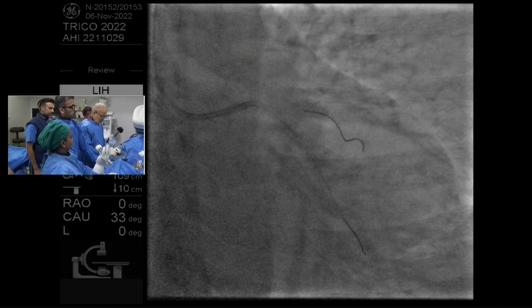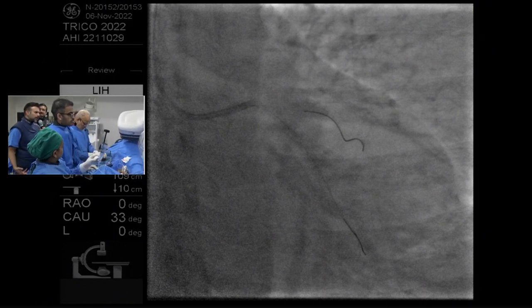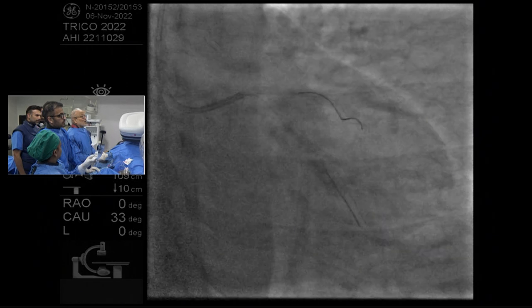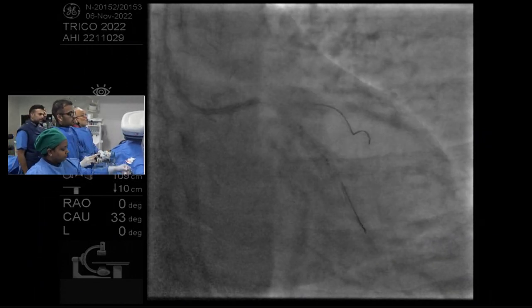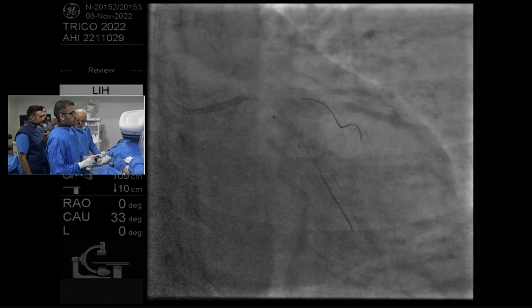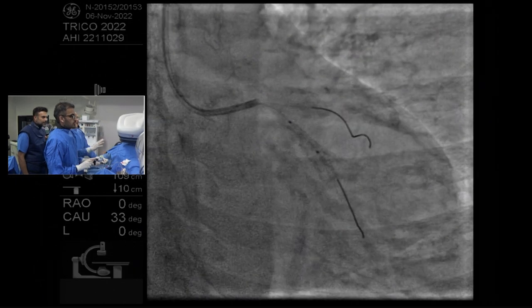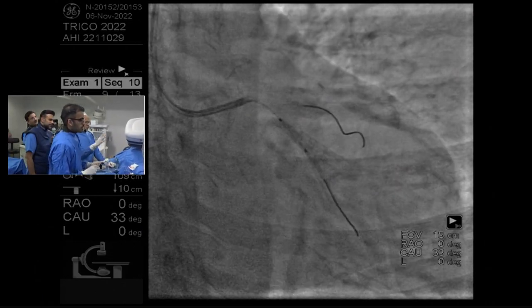You see the name, they changed it to near zero? Yeah, it should be ultra low, right? Or near zero contrast, yeah. Because it's doable with zero, but there's just no need, right? Only difference, Sanjog, I feel is I would cone in. If I were you, I would not have done anything and straight away gone ahead with the imaging. But let us do whatever you say.